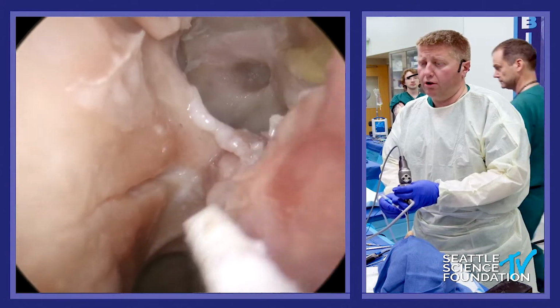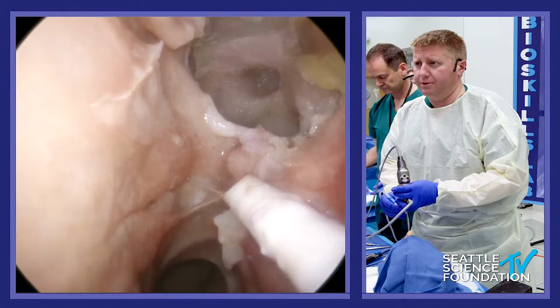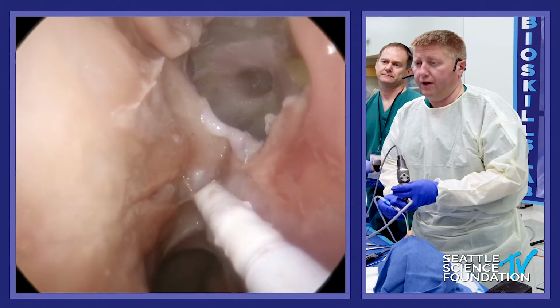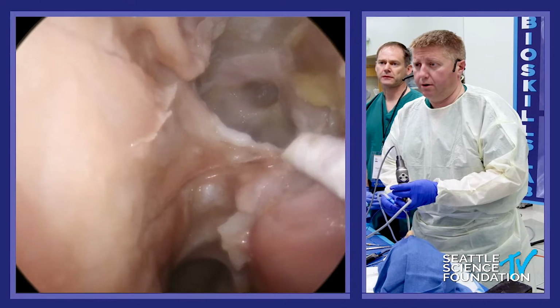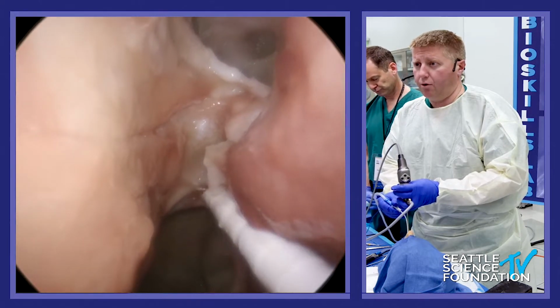So I'm working medial to the middle turbinate and identifying my sphenoid. Now, you saw earlier in Dr. O'Brien's talk the anatomy of the posterior septal branch of the sphenopalatine artery, which just exists right here on this sphenoid face. So that's the pedicle for our flap. So what you want to do is make a cut superiorly and inferiorly to make that horizontal portion.